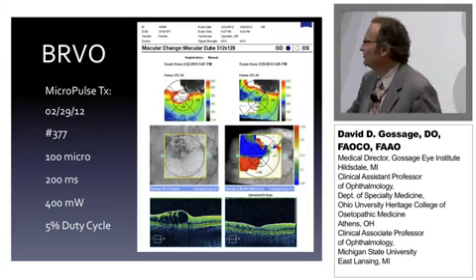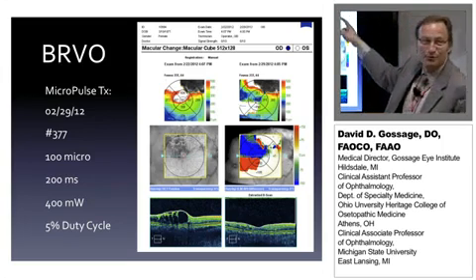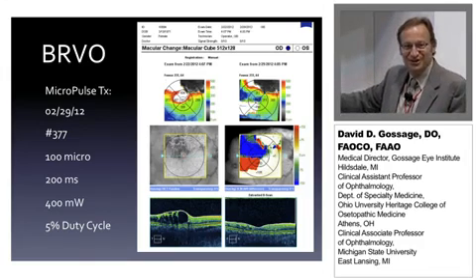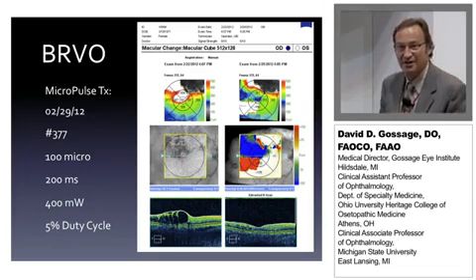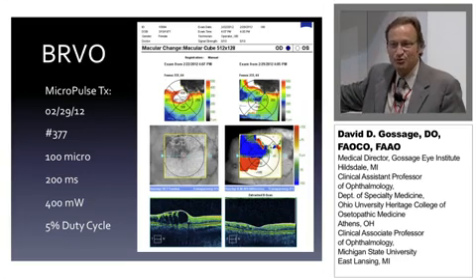Now, if you look at something, look at the date. This is February 22nd, and this is February 29th. This is less than a week out. Look at the edema, how quickly that went away. It was unbelievable. I would have never gotten an OCT or did this a week later.